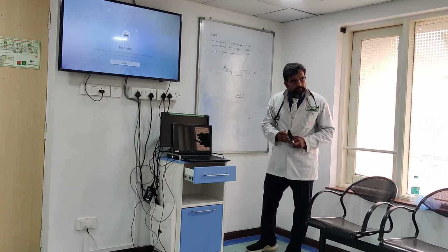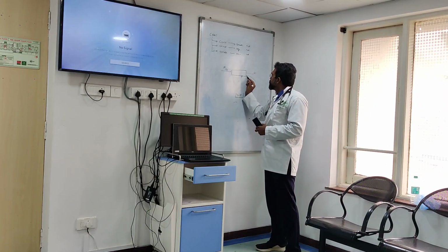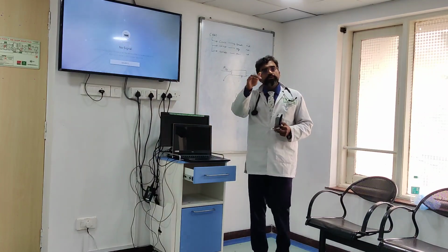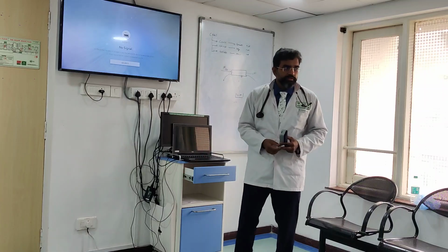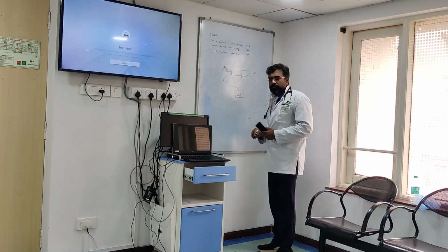What do I need to add? Dialysate. So let me add dialysate. So it is countercurrent now. I'm adding a dialysate that goes countercurrent. Where is this dialysate going to go? This 1000 ml per hour. It is going to go to the effluent. So I'm going to get all this into the effluent over here.